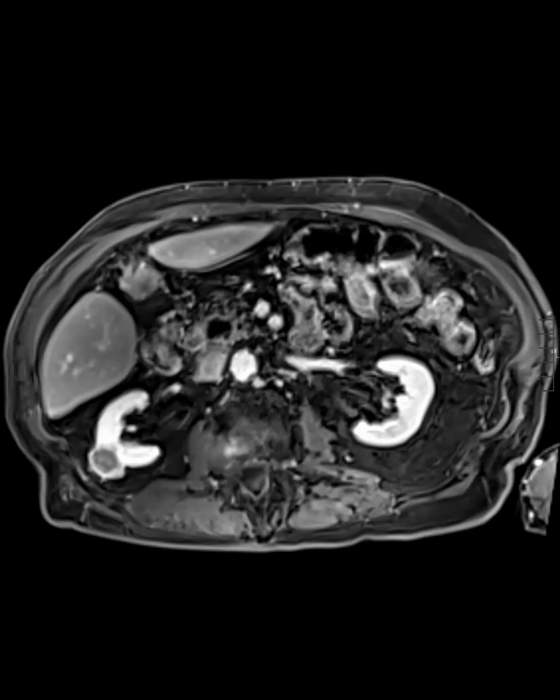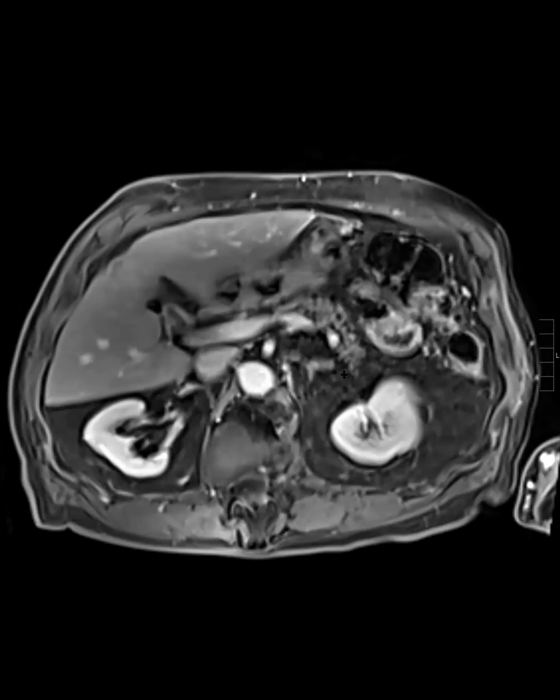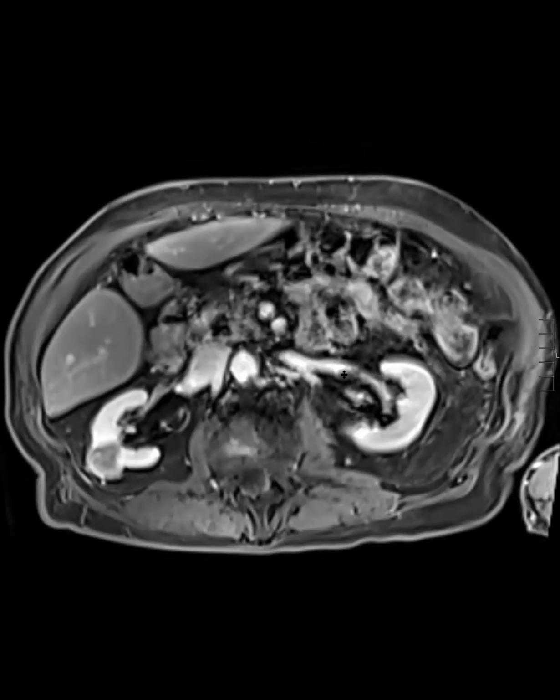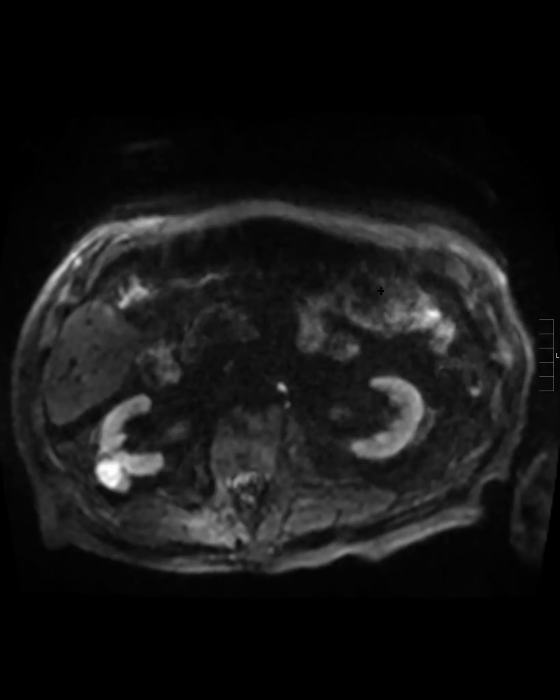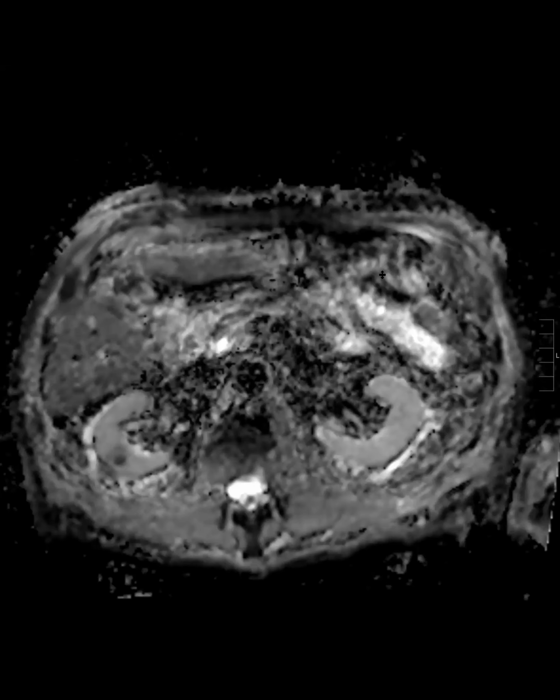I haven't started it. I mean, I heard I haven't talked about it, but Pedrosa. I put it to use about 2 or 3 times in the last few months. Oh, okay. I think it's a good algorithm, a quicker algorithm to get to the types of findings that you use to run to things like papillary RCC versus AML with no fat versus things that are more consistent with clear cell.